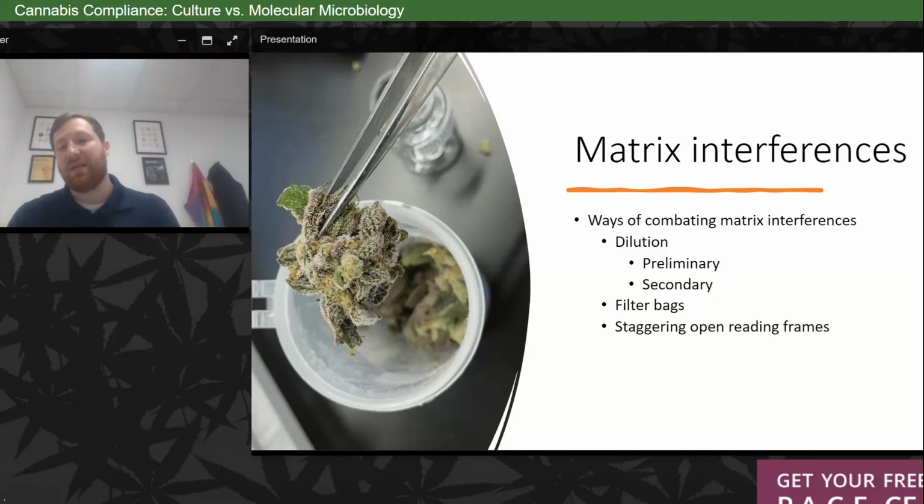so that you can get that proper HEX signal or internal control signal. Always check with your manufacturer, on both media or culture based, or if you're strictly molecular or vice versa, if you're having these matrix interferences. The second thing would be filter bags. So microbiology should be using filter bags where you can weigh on one side of the bag, add your diluent, homogenize with your hand or stomacher, and then take the eluent from the other side to completely avoid taking up a complete cannabis leaf.